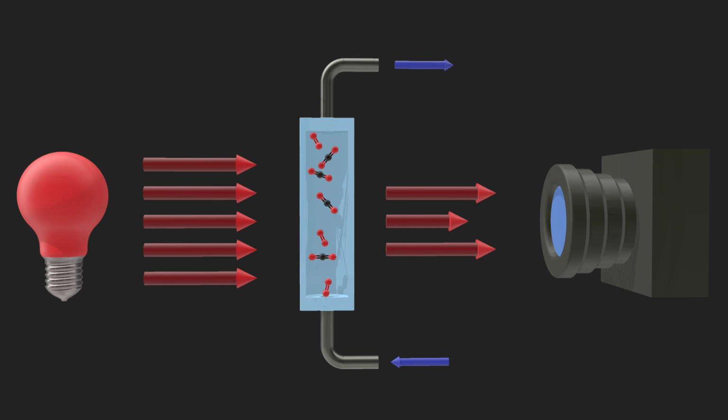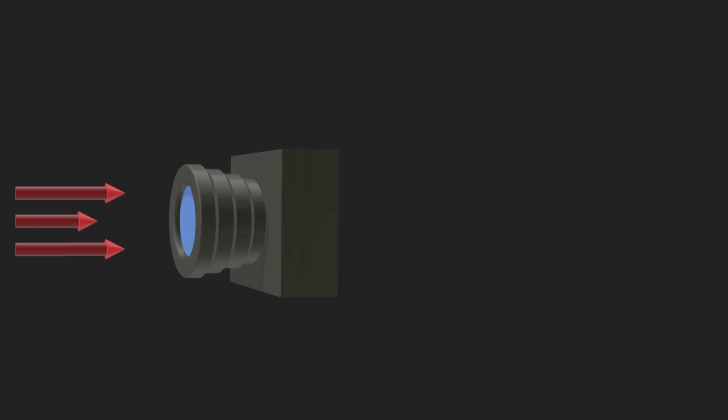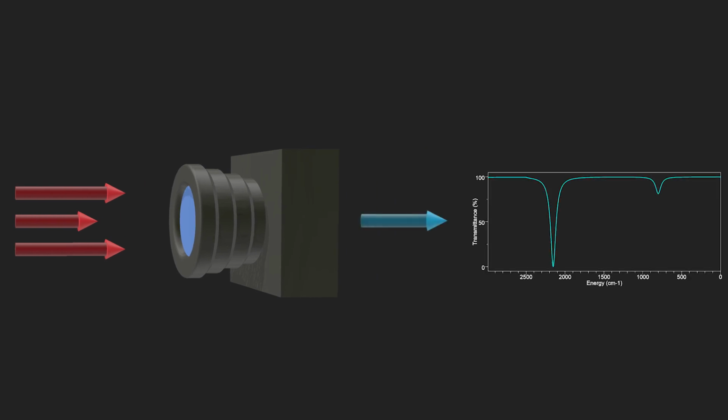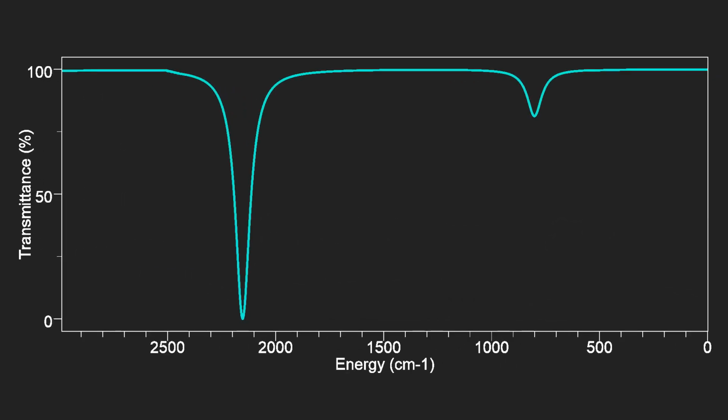Under research conditions, as in a chemistry lab, the recorded wavelengths and intensity of transmitted infrared light will be used to generate a characteristic graph, and the user or a computer algorithm can correlate the absorption peaks to functional groups known to absorb at that specific wavelength and identify the molecule. In a chemistry lab, we may be trying to identify an unknown molecule from a possible list of thousands of molecules. In the operating room, we are only concerned with about 5 molecules.